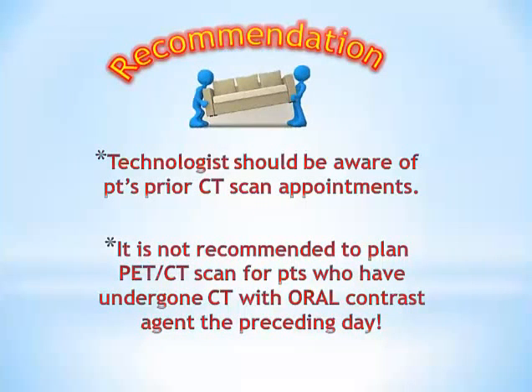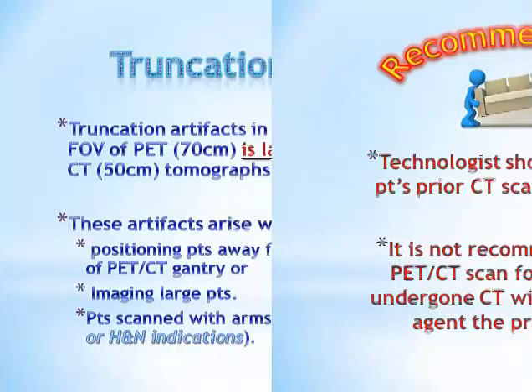The technologist should be aware of the patient's prior CT scan appointment in order to schedule the patient for the PET-CT imaging. Also, it is not recommended to plan a PET-CT scan for patients who had undergone CT with oral contrast agent the preceding day, for the reasons that I just mentioned before.